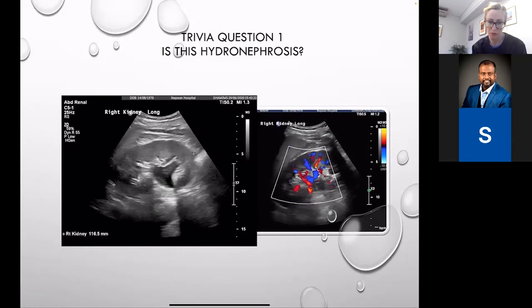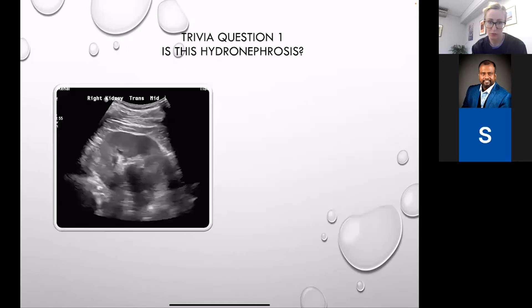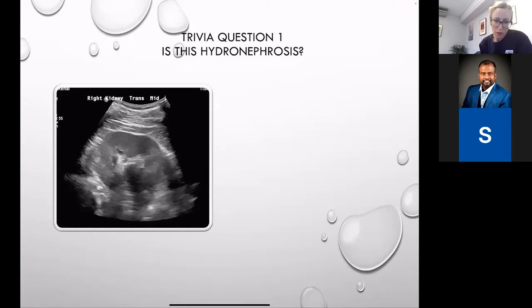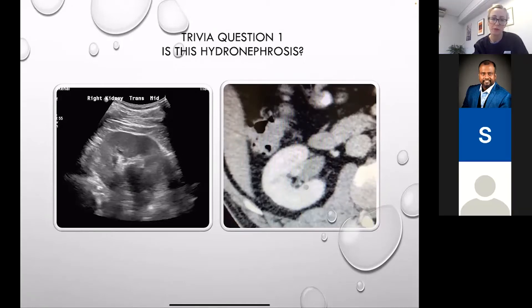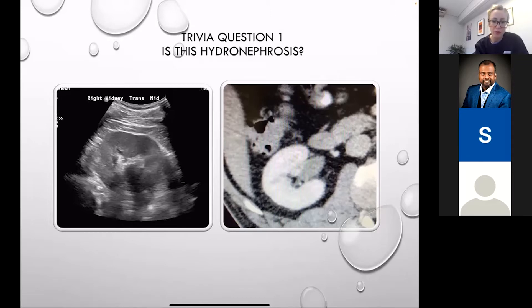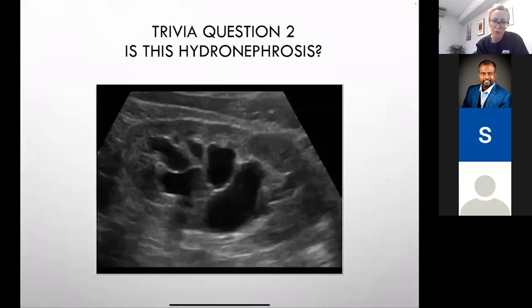It's not really fitting into all the calices — it's not connecting down to multiple channels. On a transverse view, all you see is just that one area, with no minor caliceal system dilatation at all. It's just that major caliceal pelvis kind of structure that's been dilated. On CT, this turns out to be just an extra renal pelvis. This patient actually had left-sided flank pain and ended up having diverticulitis — the kidney finding had nothing to do with the symptoms. So this is just throwing in a few possibilities that it's not actual hydronephrosis.